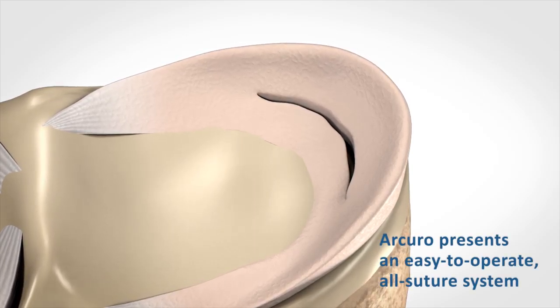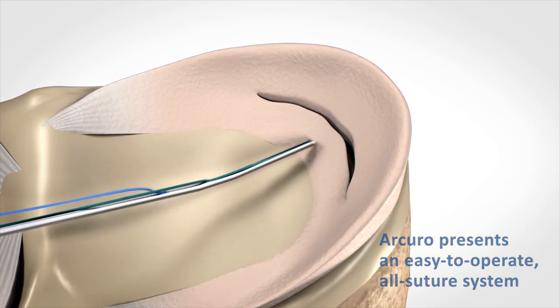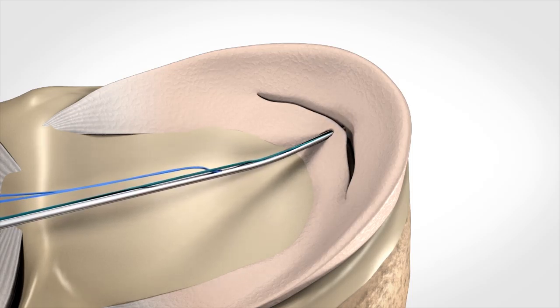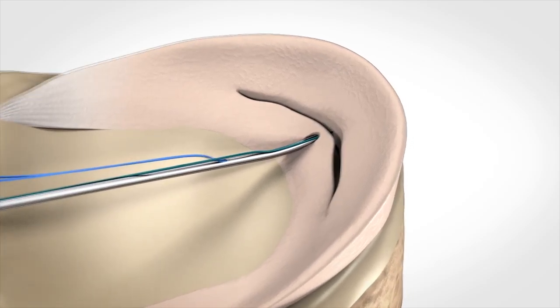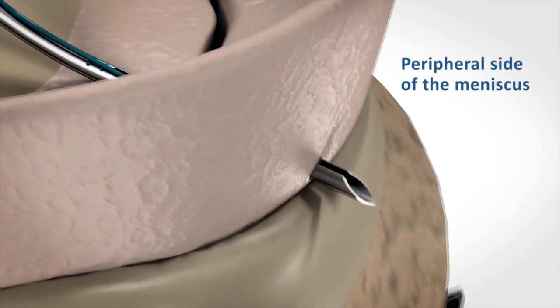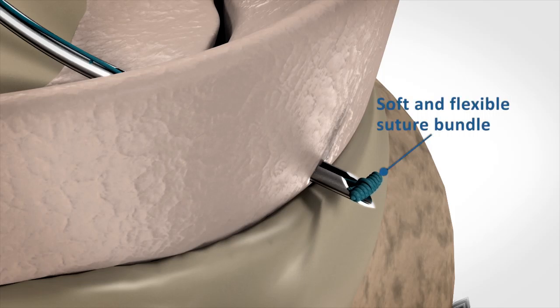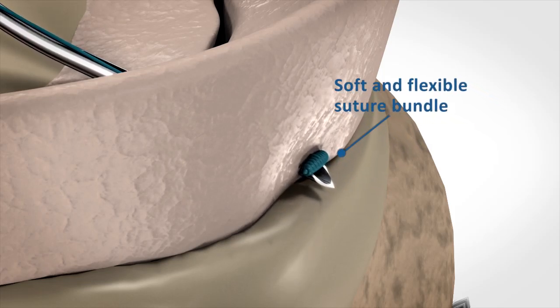Arcuro Medical fills this gap with its new easy-to-operate all-suture system. The loaded needle is inserted and advanced to the peripheral side of the meniscus. The first soft flexible suture bundle is deployed at the fixation site, where it functions as the fixation point.